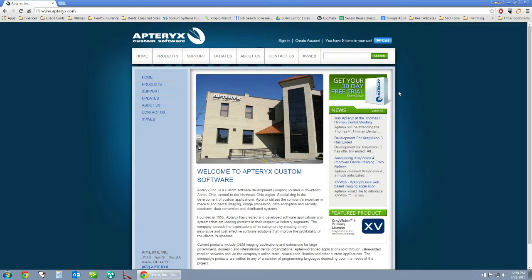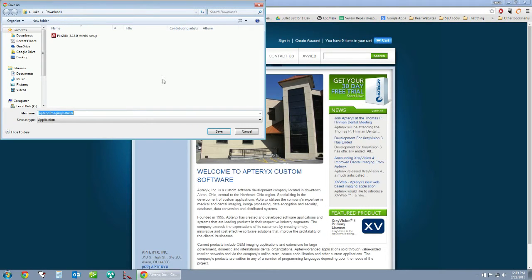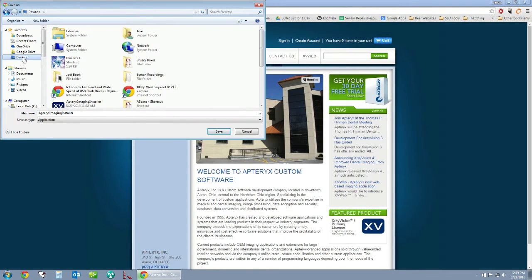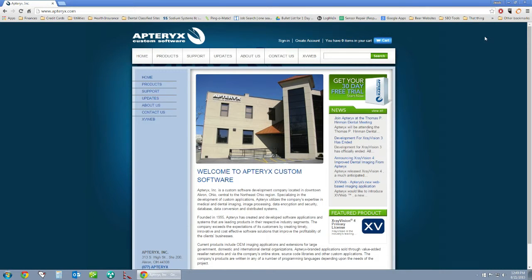This file will be used whether you want a 30-day trial to check out the software, or if you already have a license code and you're installing a permanent version on your workstations. Go ahead and click on 'Get Your 30-Day Free Trial' — it will prompt you to download the file. Save it to your desktop, which is the ideal spot. Once downloaded, go to your desktop and open it up.